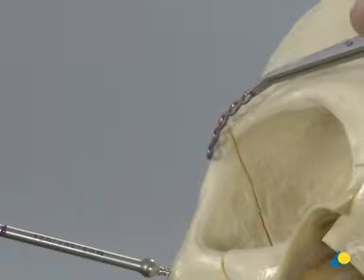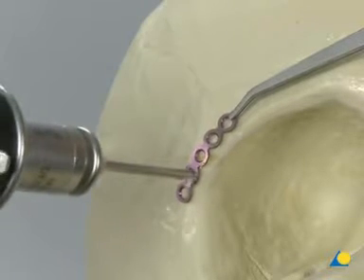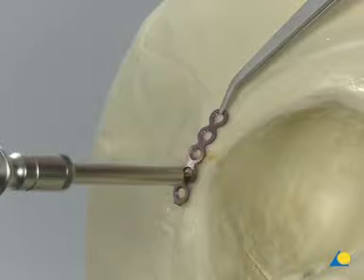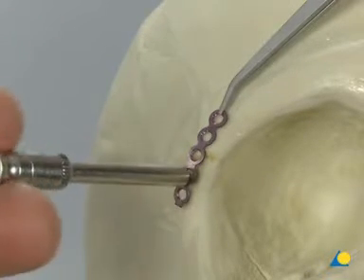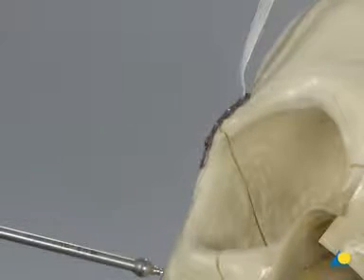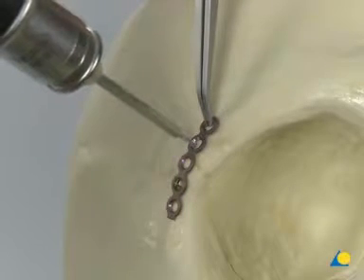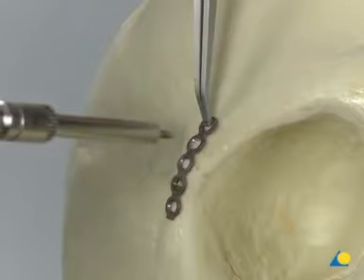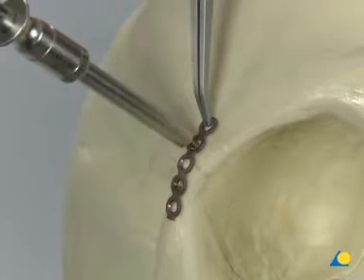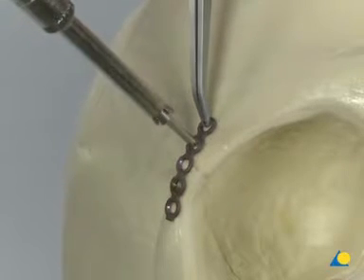The plate is held in position with the plate holding forceps. The first hole is drilled through the inferior plate hole closest to the fracture using a 1.1 mm drill bit with 6 mm stop. A 6 mm long screw is inserted using the screwdriver shaft with holding sleeve, but not tightened completely, allowing movement. The plate is positioned over the orbital rim above the fracture gap and pulled superiorly to close the gap. A second hole is drilled just superior to the fracture line, and another 6 mm screw is inserted. The remaining screws will be inserted after other fractures are stabilized. The hole over the fracture line is not used.